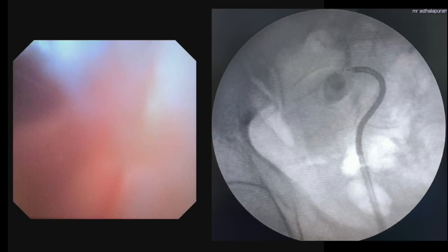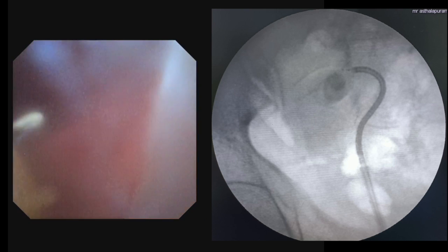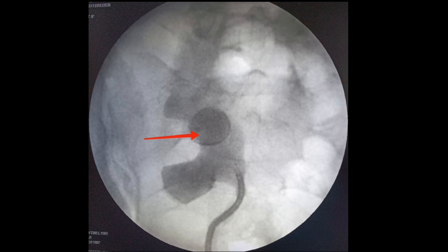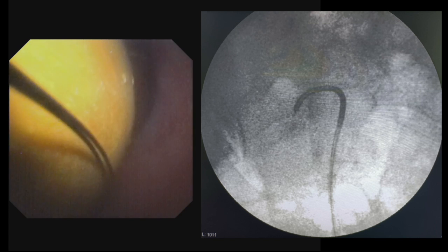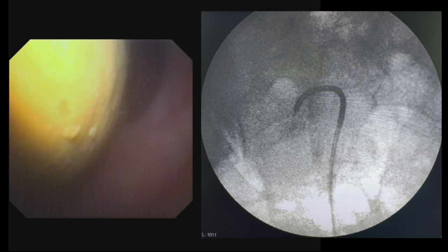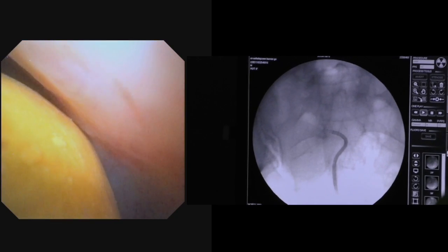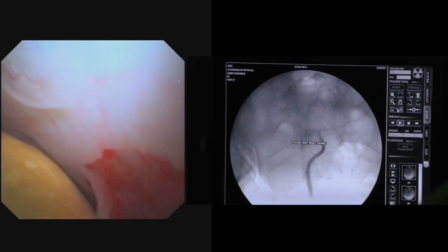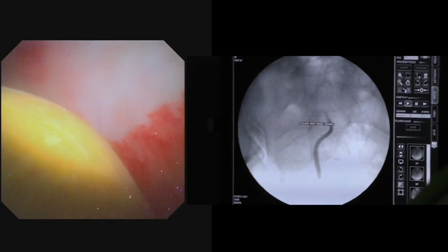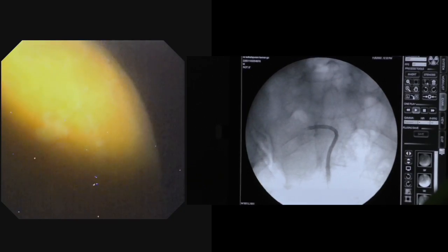First, we inspected the calyces, and finally at an awkward angle the stone was visible in the middle calyx. We decided to basket the stone. Basketing was done and the stone was relocated from the abnormally located middle calyx to a more favorable upper calyx. A 2.2 French Encircle basket was used.